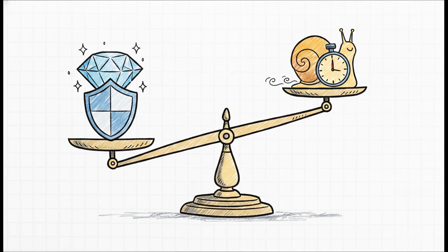So the big takeaway here is that spin echo gives you absolutely gorgeous, excellent image quality. It gives you true T2 weighting and is incredibly robust against artifacts. But you pay a pretty steep price for all those 180-degree pulses. They take a lot of time to apply, which means spin echo sequences have noticeably longer scan times.